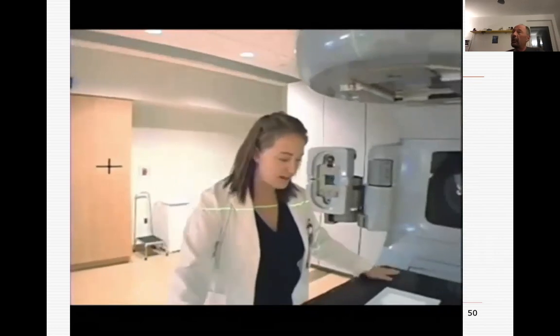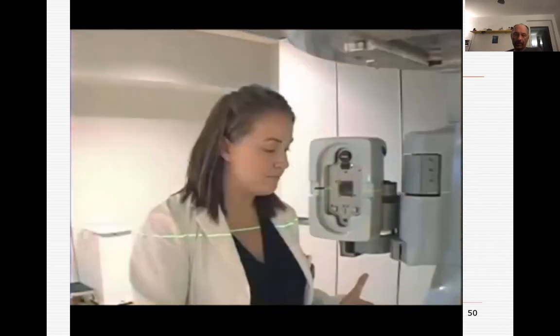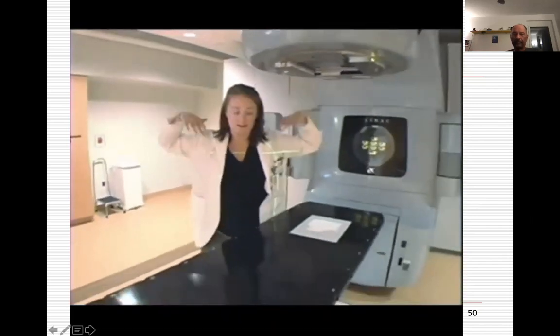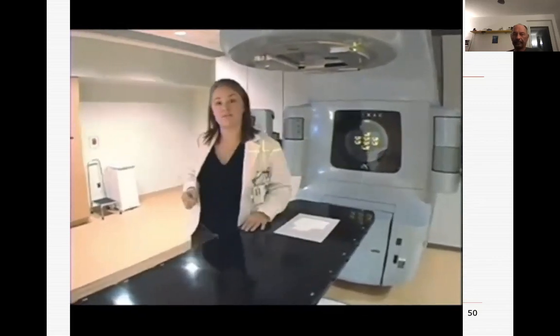Okay, this is of course for the linear accelerators that we use in radiotherapy. The patient first has a CT scan, where the doctor plans out where they're going to treat. Then they come in here and we position them on the bed in whatever treatment position they need. So, for example, if you're getting breast cancer treatment, we'll have their arms up in the air so that we can position them with their breasts in an open position. And we give them little tattoos for positioning.